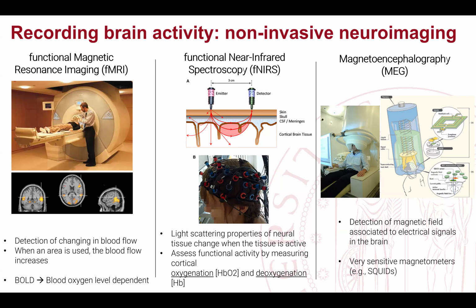Why are we not always using the magnetoencephalography? Because again, it's not very portable and not very cheap. So it is very interesting.